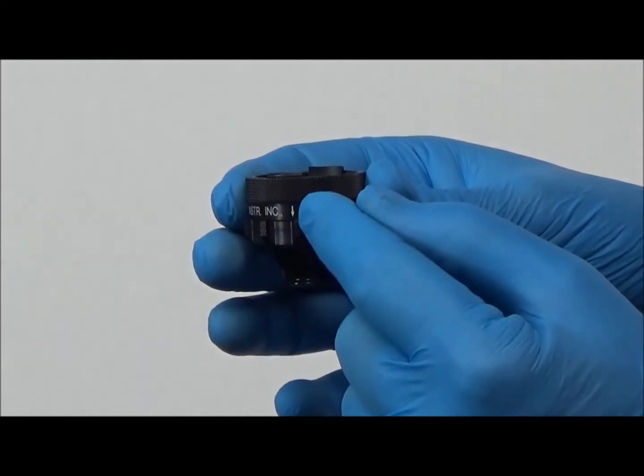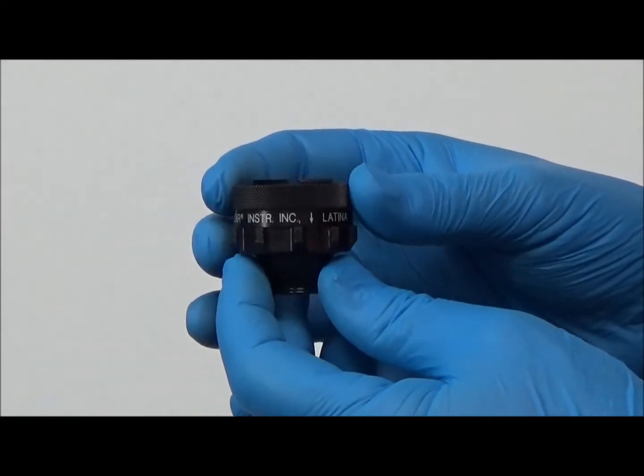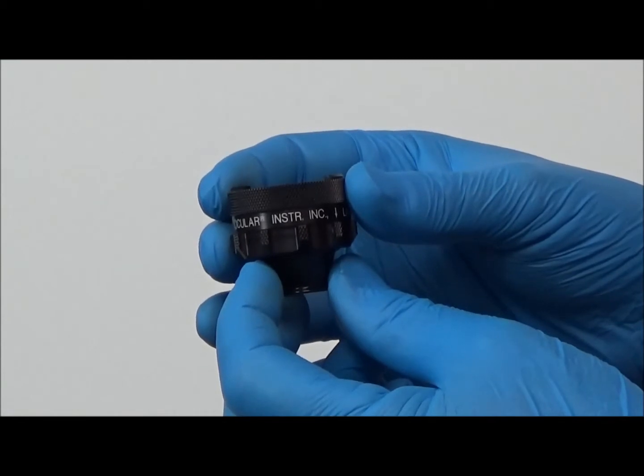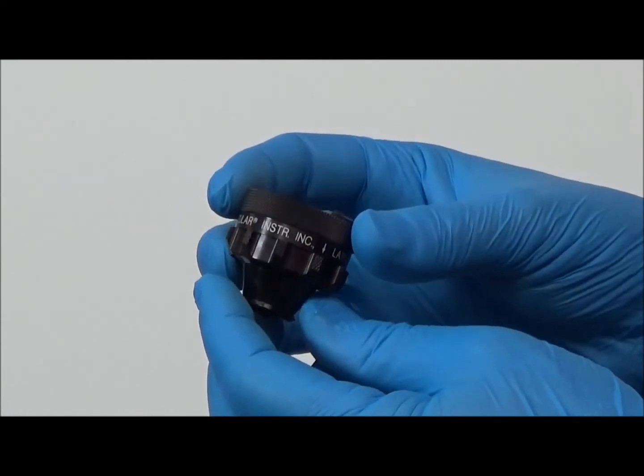For lenses with internal reference bar figures, such as the Latina 5-bar lens shown here, a specific angular rotation of the lens is required.